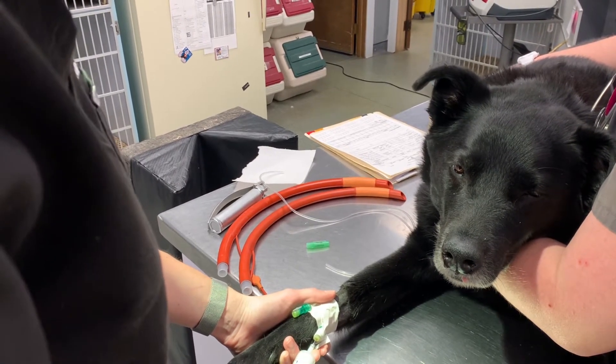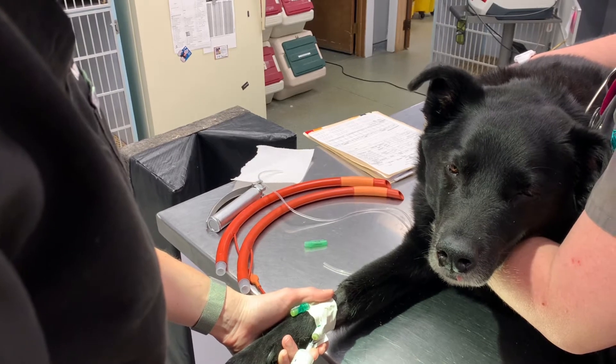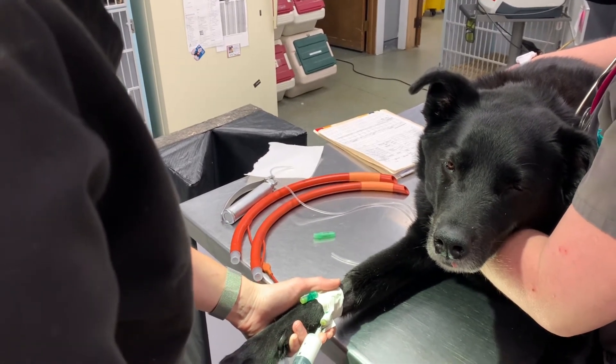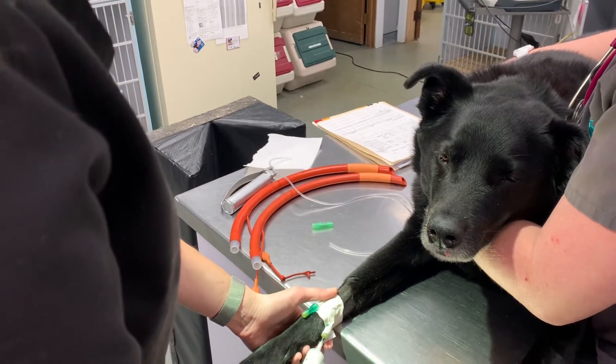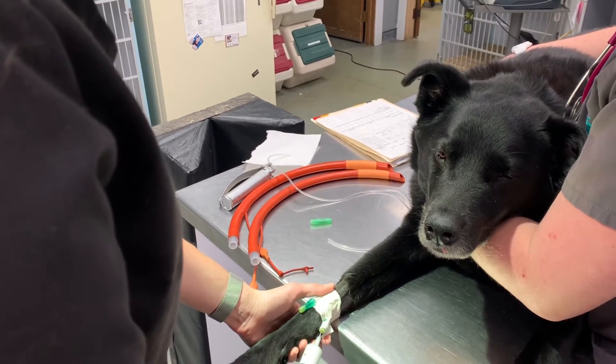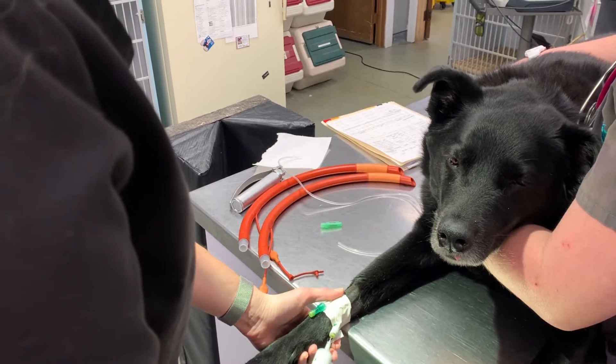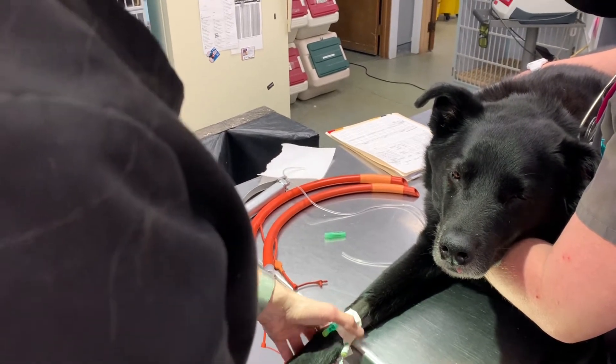If the canine officers are chewing, awake, or flailing, then they don't need to be intubated. That is a great way to get somebody bitten or to have one of the dogs break or chew the tube — so that's the last thing we want.